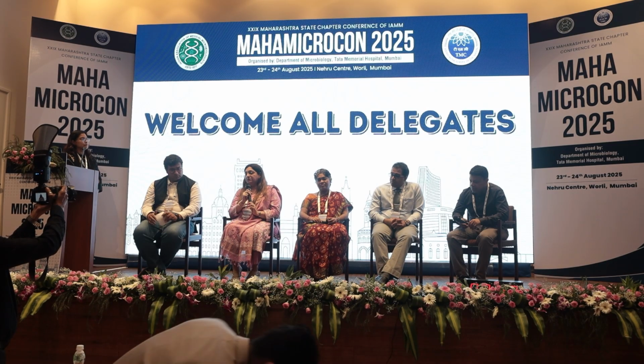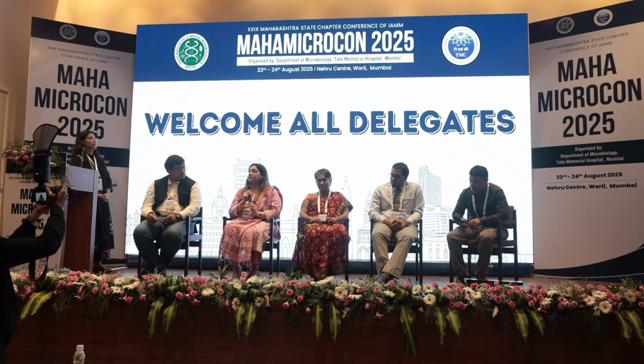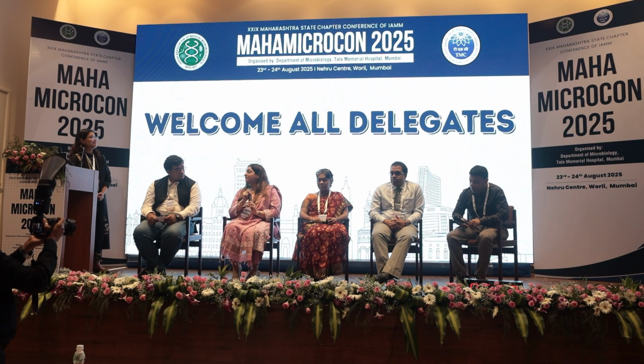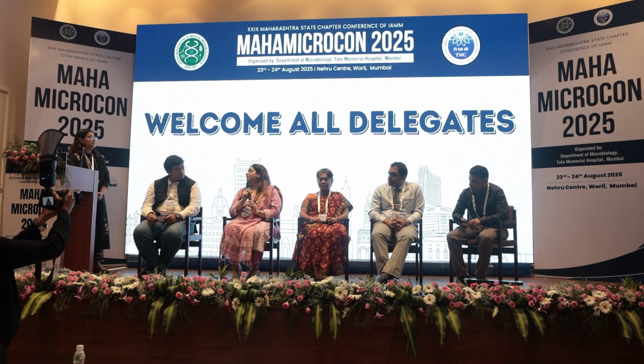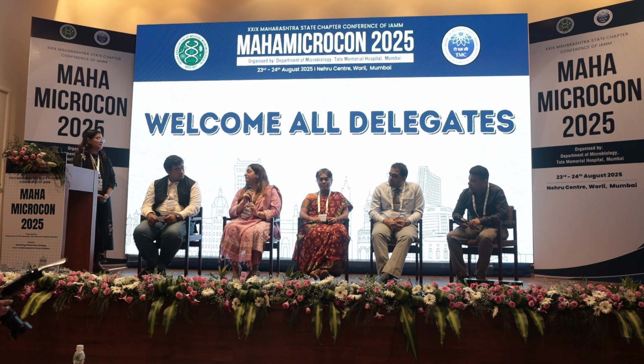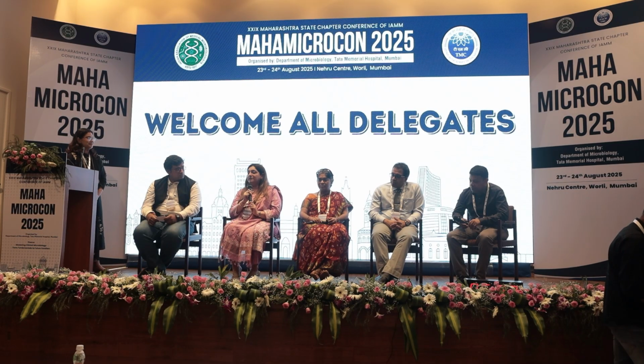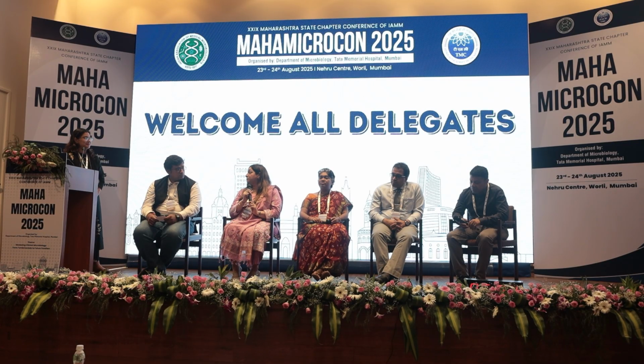We could look at starting a little slow, starting with the critical care unit patients, and then scaling up and going wider to all the other patients that we see in government sector hospitals. And finally, this could be used as a first-line test, because we are looking at direct samples and a turnaround time of 24 hours. We have clinicians today in the government sector who are asking us for quicker reports, and for gene targets responsible for resistant mutations. So I think yes, the final aim should be taking it to the masses.